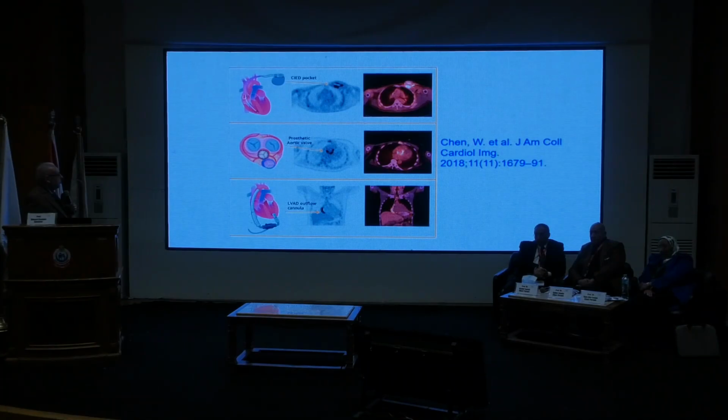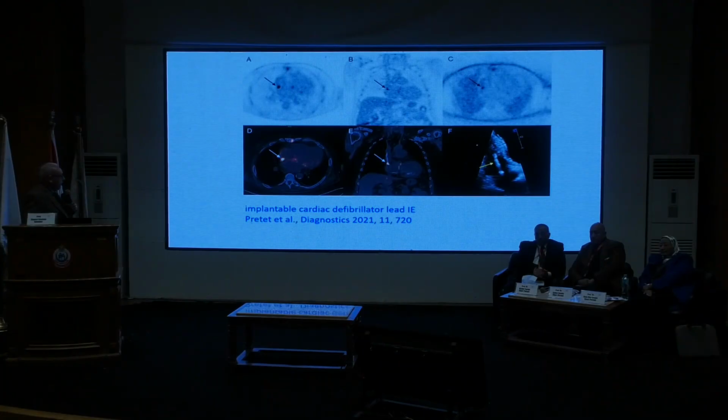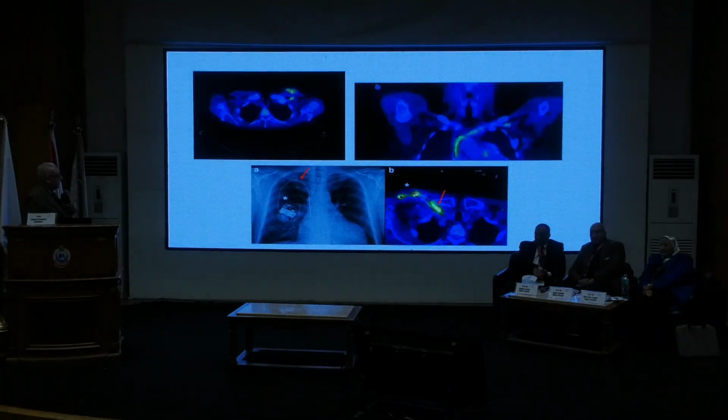This is an example of infection related to cardiac device, whether infection related to the pockets, here, or related to the leads, or of course here this is related to the valve. Infection related to leads, infection related to leads and pockets of cardiac device.